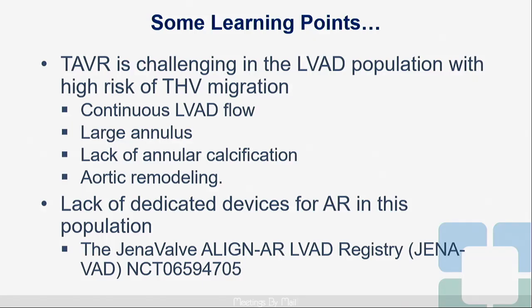Yeah. So the thing is that we saw, after 10 minutes, the valve shifting, and you have many configurations of LVOT, but this was a flare. And we spoke, there's a guy in Colombia that's been going crazy about doing AI with this, and they asked him, and he identified those phenotypes. And the other thing is, why not ballooning? Because the ballooning still would not anchor the valve. You can expand it, but the problem now is not a problem of apposition, it's a problem that it's shifting down, and maybe you don't have a skirt to seal the annulus. So I think that the CoreValve is a great stent to anchor a Sapien, and that's what we did. Okay, thanks.